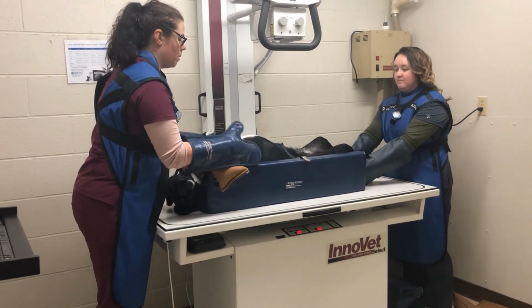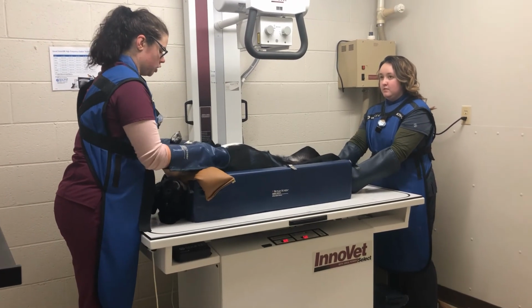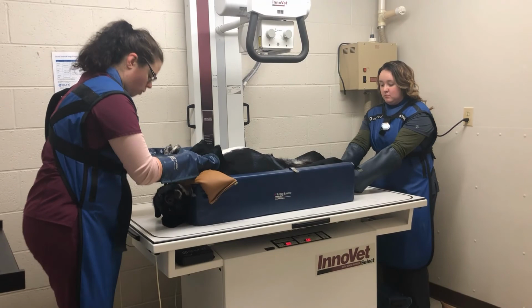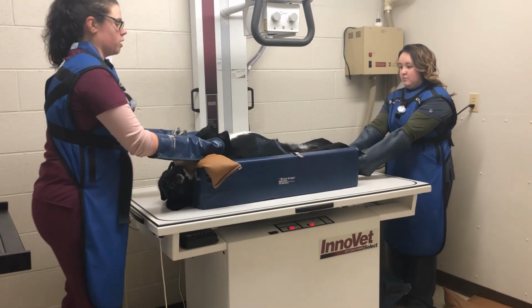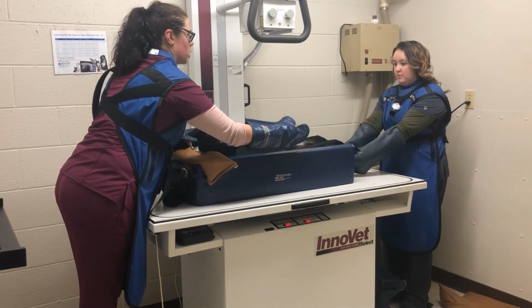Alright, we're going to take the minute 0 VD x-ray of Willow's barium study. So we've got her in the ventrodorsal position. We have her arms pulled forward, and we have our machine set up with our marker. So we are going to put the correct marker in there.